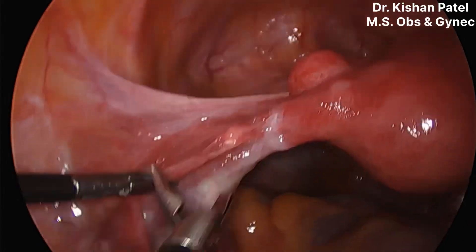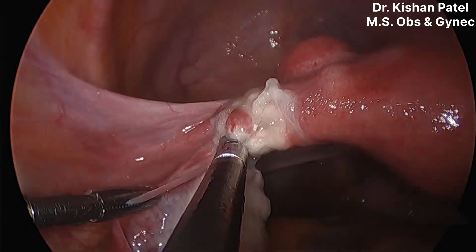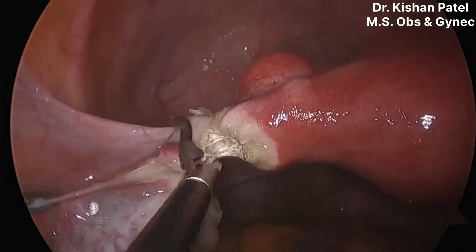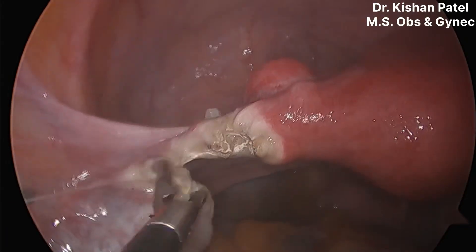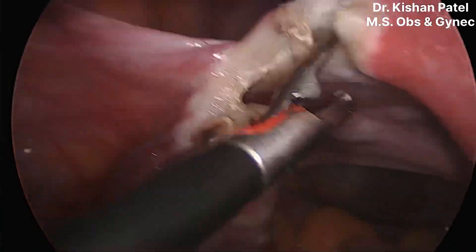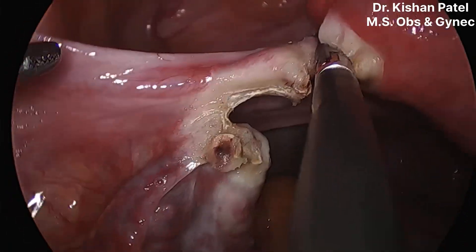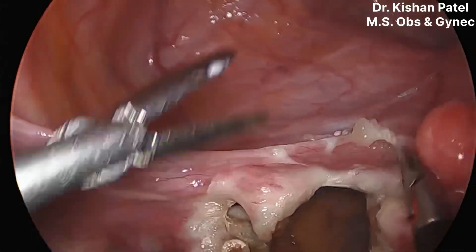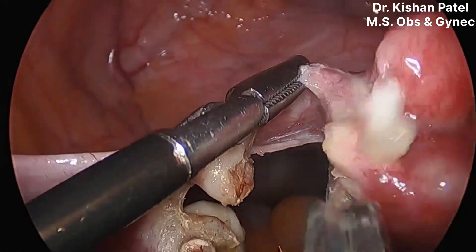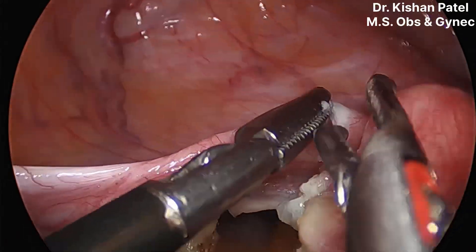Our steps are simple and not changing in every TLH. In the left corner, structures are the fallopian tube, ovarian ligament, followed by round ligament. We will cut it and make a small nick posteriorly. Whenever I cut the ovarian ligament, I always keep a nick posteriorly for demarcation so I should not go laterally beyond that. Here you can see the dense bladder adhesion, so I will keep towards the uterus and cut the peritoneum over the uterus without damaging the bladder, going small bites gradually.